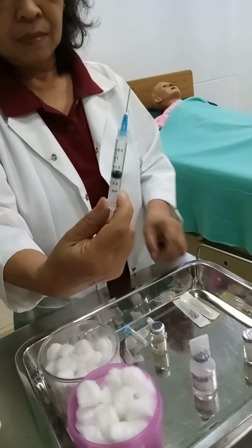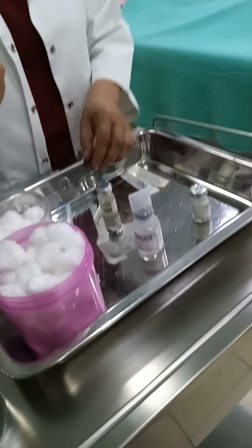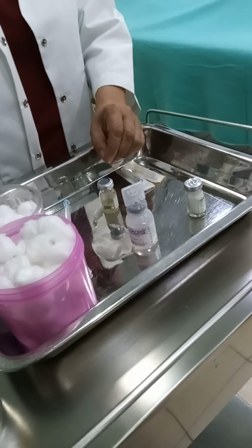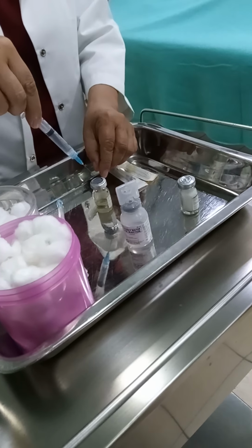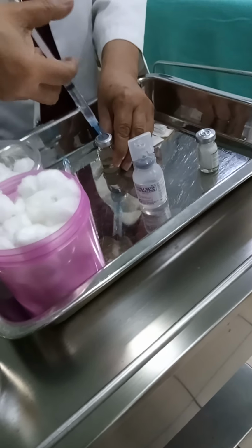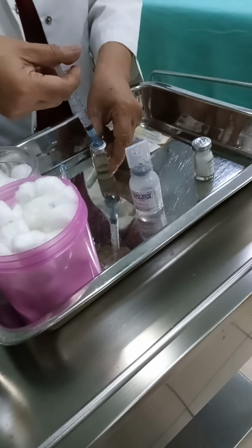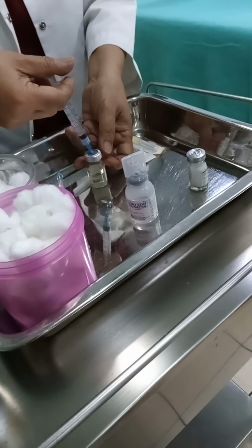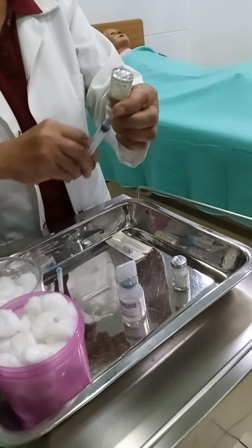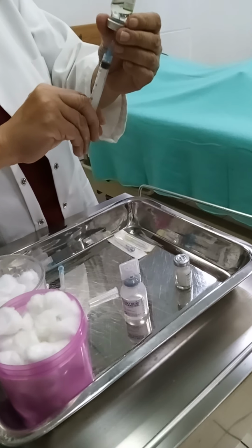Set the vial on a flat surface and insert the needle tip through the center of the rubber seal. Inject air into the vial, holding on to the plunger firmly. Invert the vial, keeping a firm hold of the syringe and plunger.